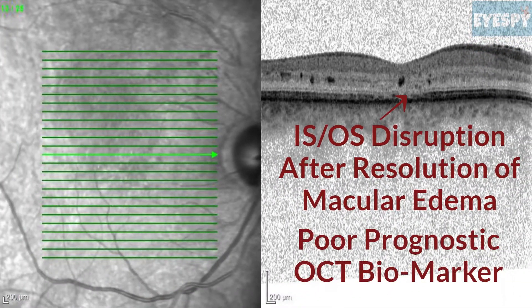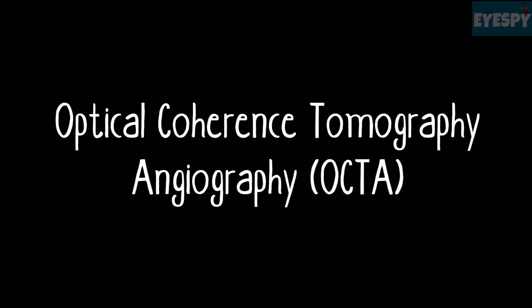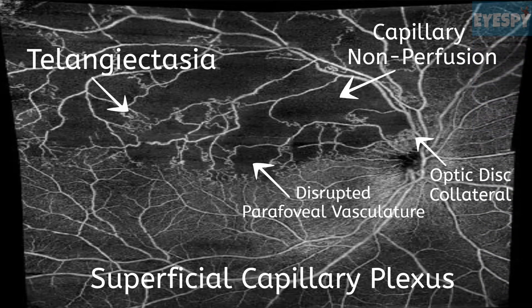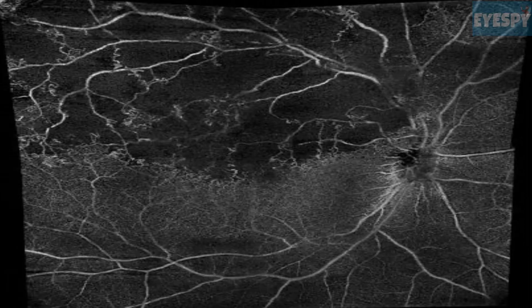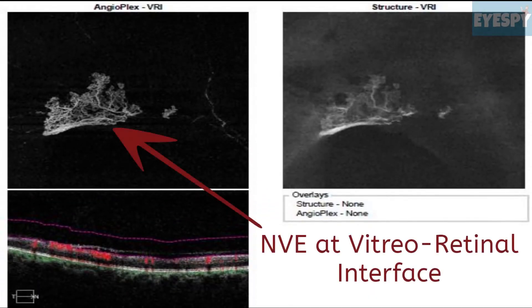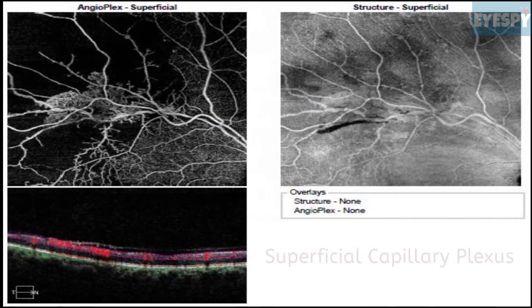On OCT angiography, capillary non-perfusion, telangiectasia, disrupted parafoveal vasculature, and optic disc collaterals may be seen on the superficial capillary plexus. Capillary non-perfusion areas are more markedly seen in the deep capillary plexus. Presence of blood vessels at the vitreoretinal interface is suggestive of neovascularization.